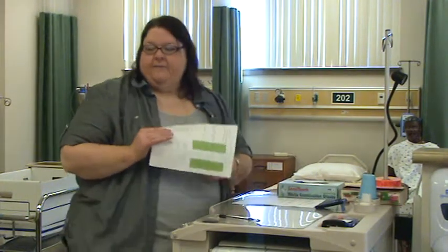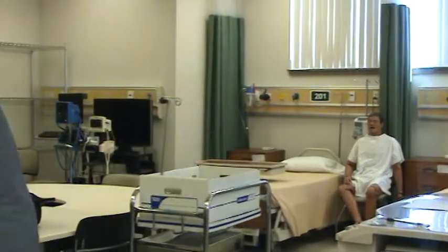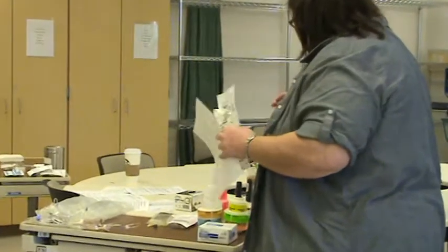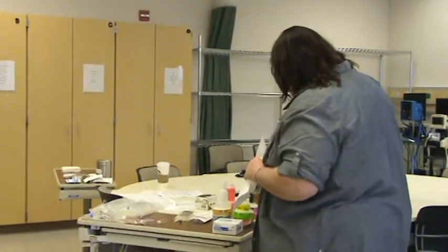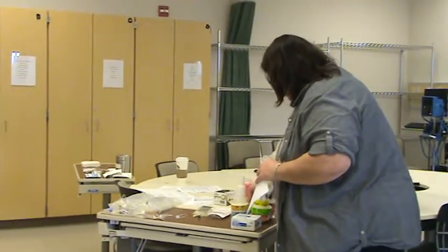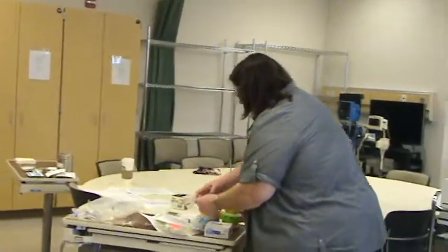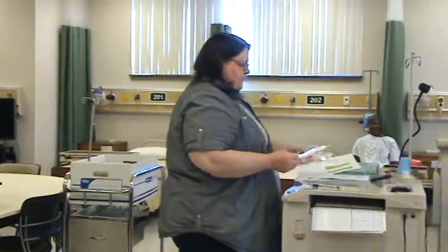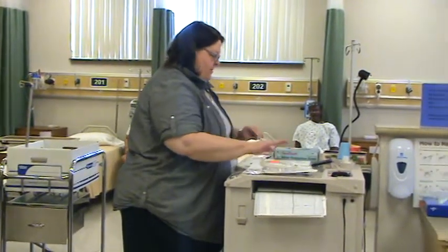My order is checked. Step two is assemble equipment. I'm going to take my MAR with me, come over to the med room, find my IV bag, find the correct tubing, and find a date-to-be-changed sticker. It's Monday, so I need the Thursday stickers. The rest of the equipment is at my cart.